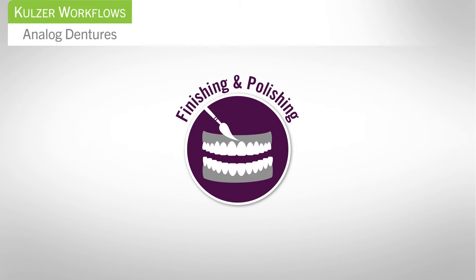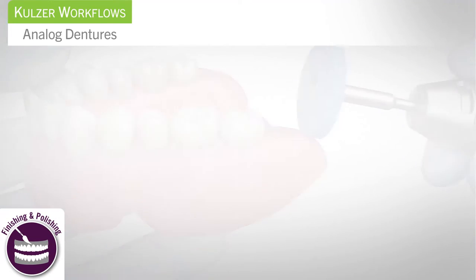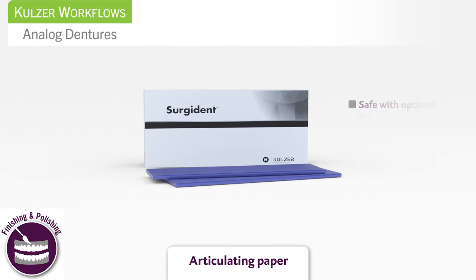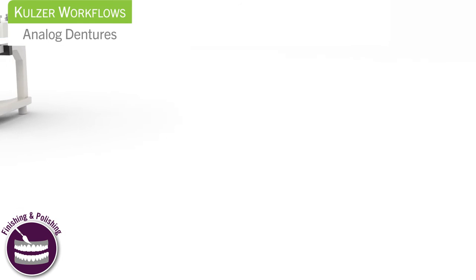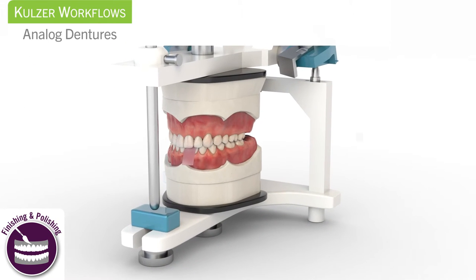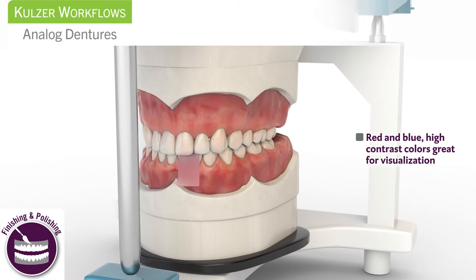Step 5: Finishing and Polishing. Remove the flask from the denture and polish it. Surgident Articulating Paper is completely biocompatible and has a short drying time. Mount the denture on the articulator and verify the occlusion with Surgident Articulating Paper. The high contrast red and blue colors provide excellent visualization.